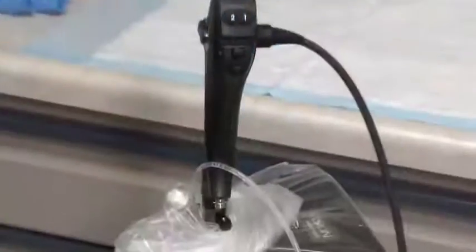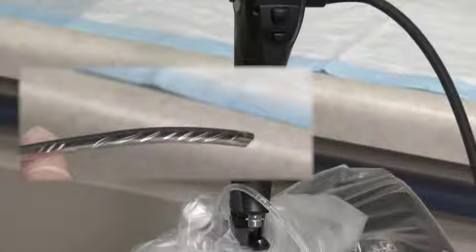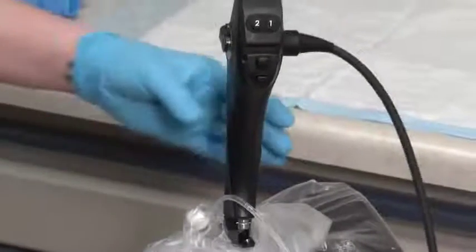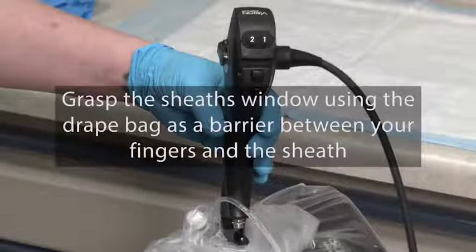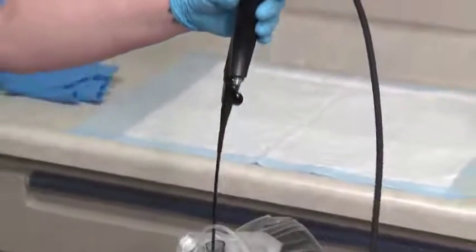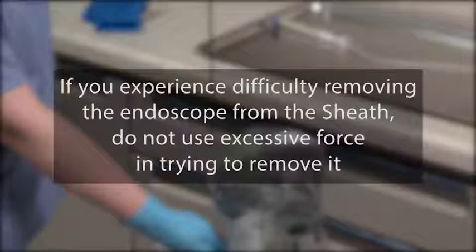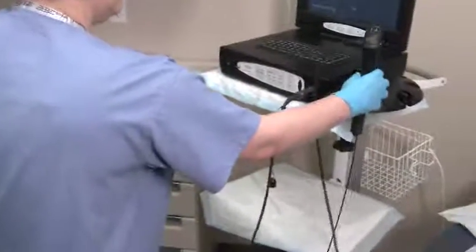Rotate the locking knob into the vertical position so that it is aligned with the slot on the endosheath connector. Using the angulation lever, articulate the distal bending section of the endoscope into the straight or neutral position. Hold the endoscope's control body in one hand. Using the bottom outside portion of the drape bag as a barrier between your fingers and the sheath, gently and carefully grasp the sheath's window. Then slowly and gently withdraw the scope from the sheath. Do not twist the endoscope when removing it from the sheath, as doing so can damage the insertion tube. If you experience difficulty removing the endoscope from the sheath, do not use excessive force in trying to remove it. Place the endoscope in a non-contaminated area.